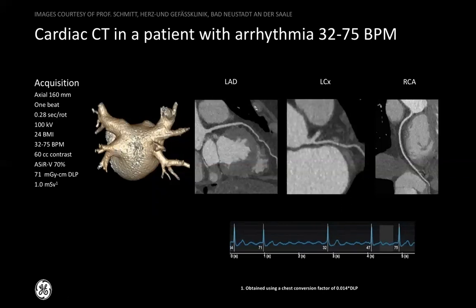It does preclude making good pictures with magnetic resonance unless you do some clever gating. You can imagine this also screws up SPECT, PET, anything else that requires multiple beats. But now that we're down to one heartbeat, you can just wait and trigger on any one of these and take all of your data in 160 milliseconds, and you're okay. And then you get a picture of a vessel that looks darn good, right?